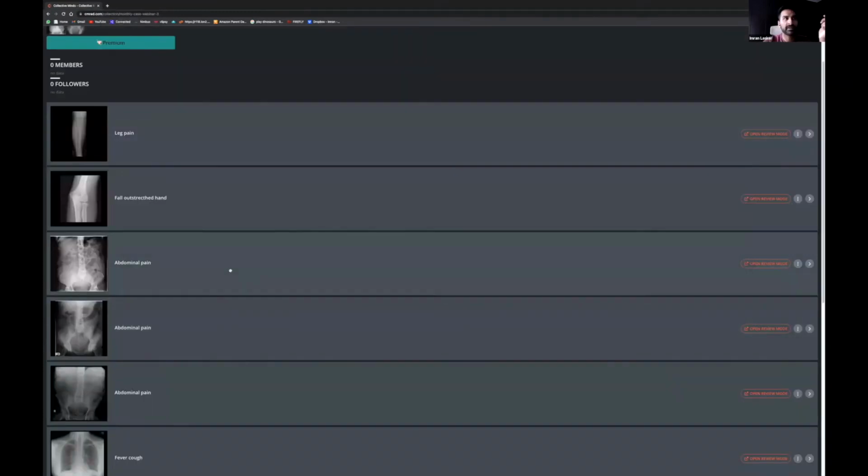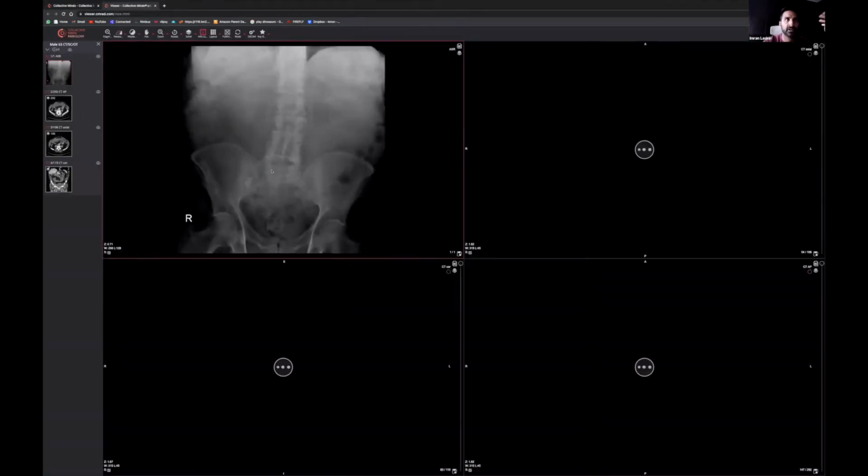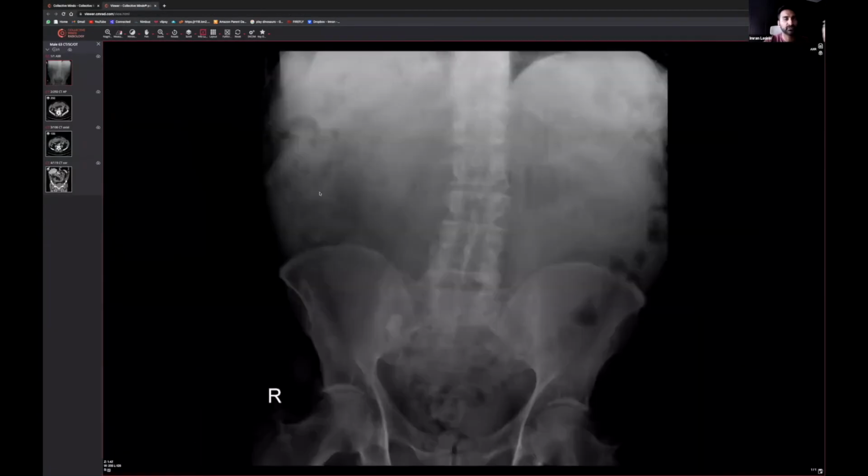So hopefully, for those of you that are coming to these talks regularly, you can see that I'm starting to introduce a bit of cross-sectional imaging as we go through them, because in the previous ones we were just hammering a few x-rays, and to make things easier or more interesting, I'm going to start putting in a few small CTs and working through it with everyone here.